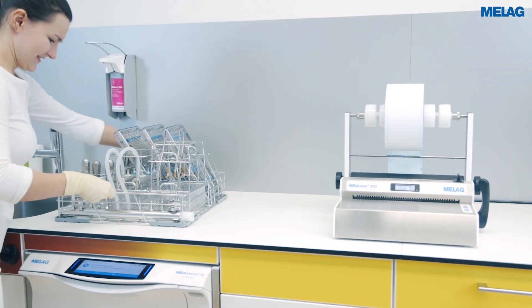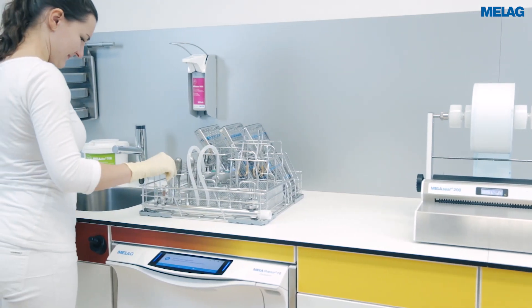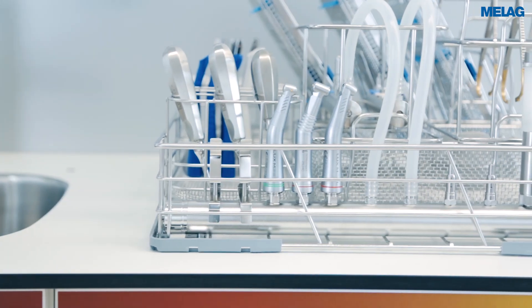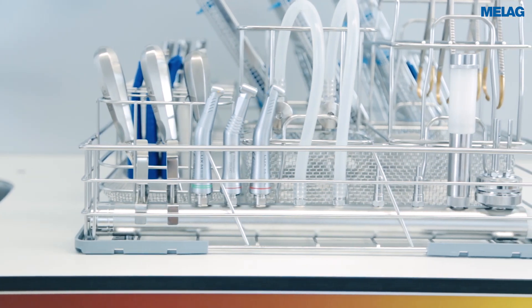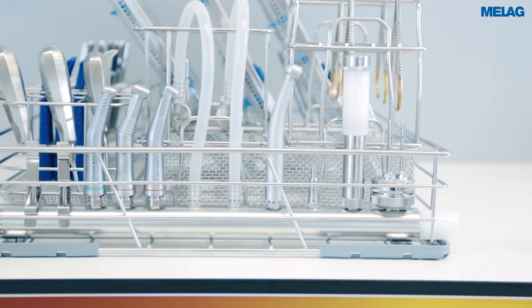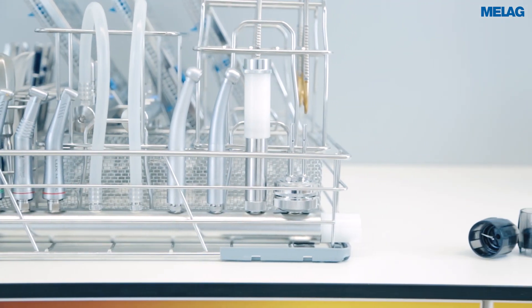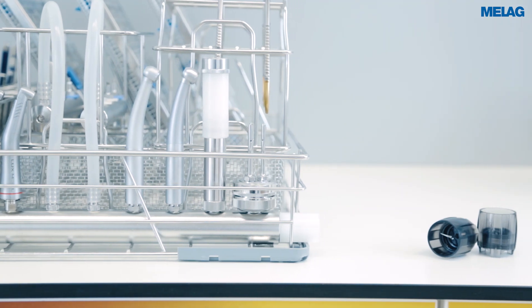When decontaminating transfer instruments, use the corresponding adapter on the injector rail. After decontaminating the transfer instruments in the MELAtherm 10 Evolution, we recommend blowing them out with compressed air and treating them in accordance with the manufacturer's specifications.